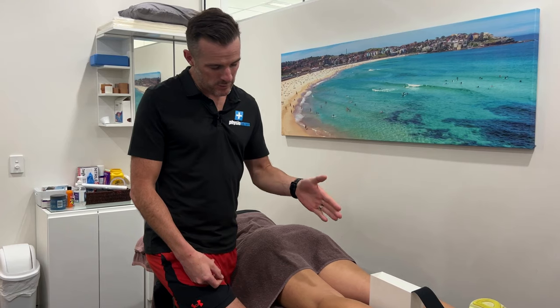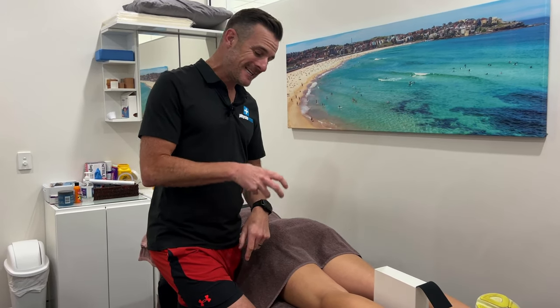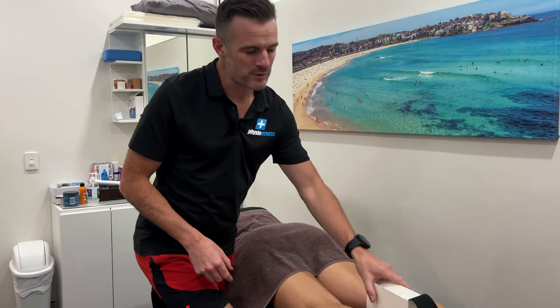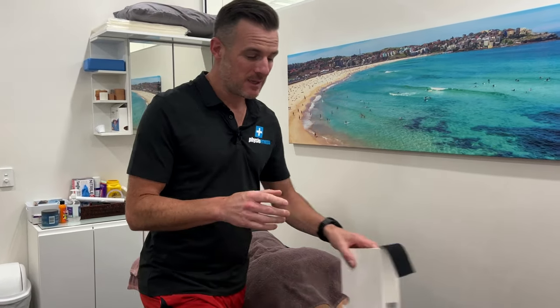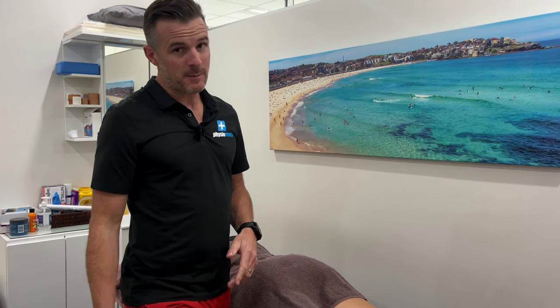I'll show you the way we do it for general tightness and general muscle guarding, and also when you've got a bit of a tear to try and protect that tear as we overlay it like a band-aid.